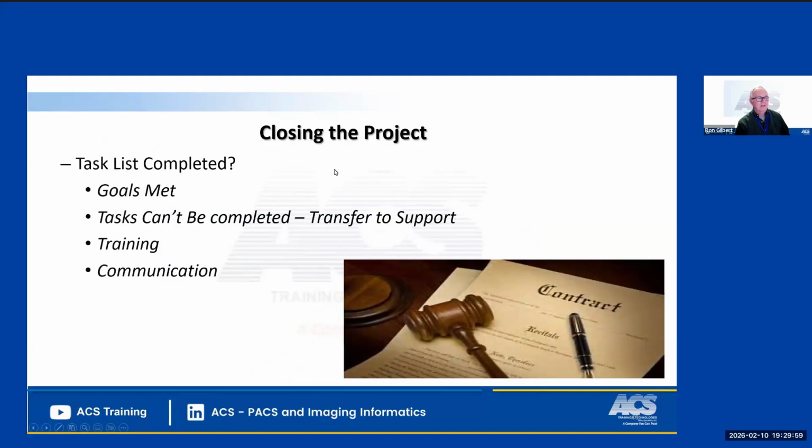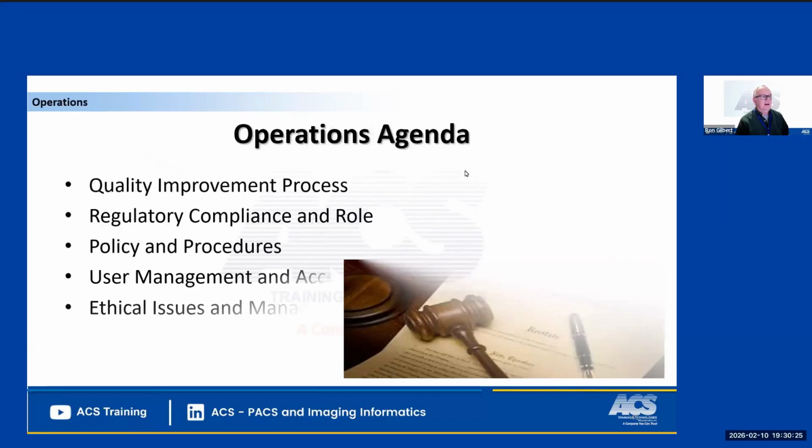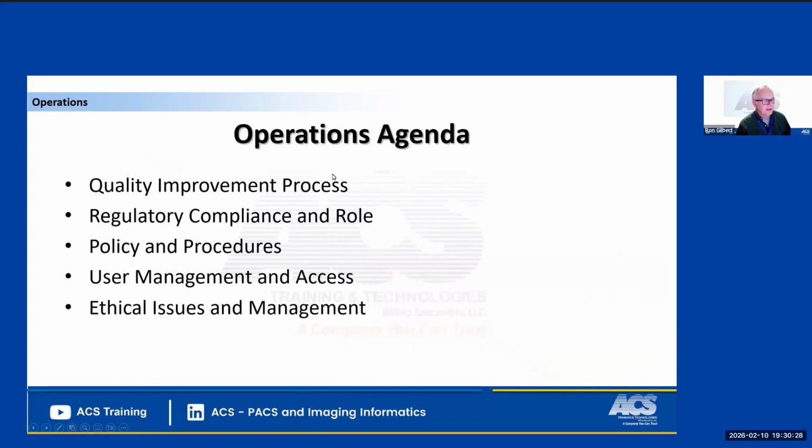Then closing the project, what I like to say is that going live isn't turning on the new system, but it's turning off the old system. What all do you have to do before you can go live? And sometimes the tasks can't all be completed because of different problems, backlog, other people didn't do their job. So you just got to understand, what is the minimum it's going to take to get the system going, and then everything else will transfer to support. I did project management myself, so I understand that. I also was in sales, so I understand how to sell things, so I understand how to buy things. So I can tell you firsthand some good ideas how to deal with this.